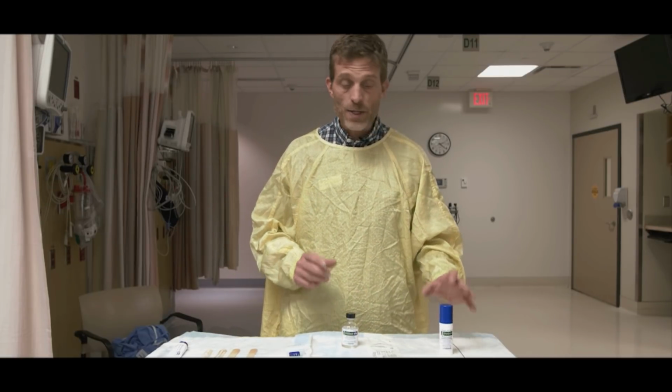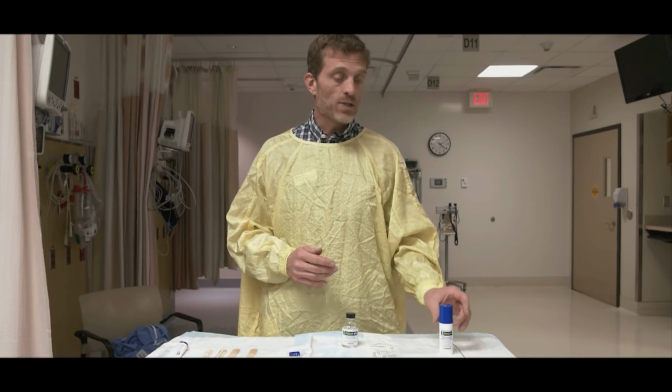I have it here, and we didn't use it. Just in the event that we had some difficulty anesthetizing the deeper structures, if we had some lidocaine in the bank, because we only used 320 milligrams, we potentially could have used this to spray the epiglottis, to spray the cords, just to get some extra anesthesia, but only if you've got lots of room with your lidocaine dosing.